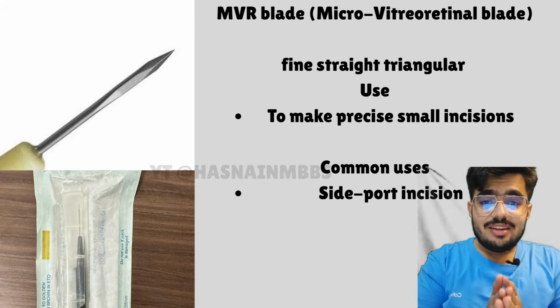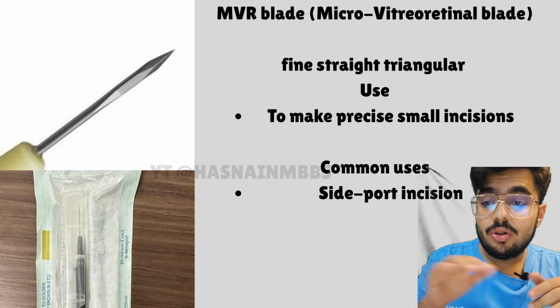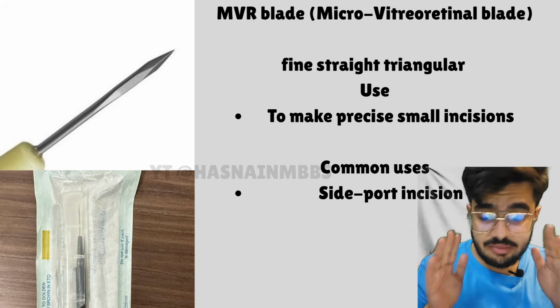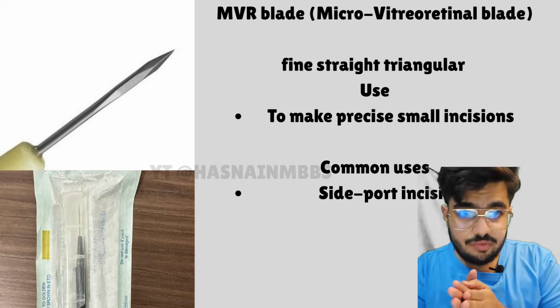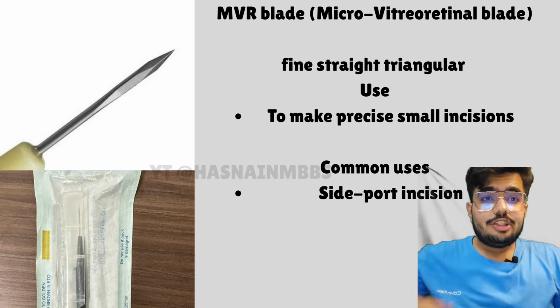I hope you guys understand how the instruments go, and I have tried my best to simplify all these instruments in such an easy manner that even the Viva questions which may be asked from the instruments, I have tried to explain.